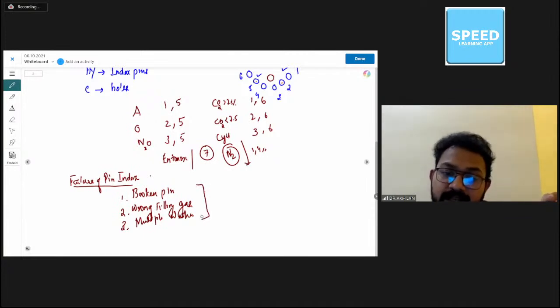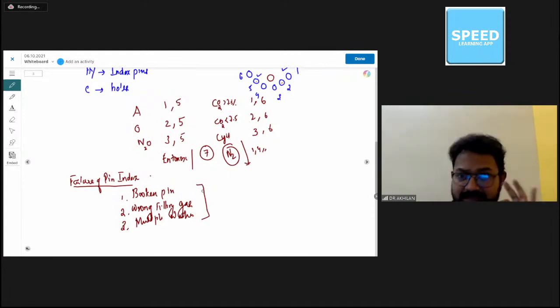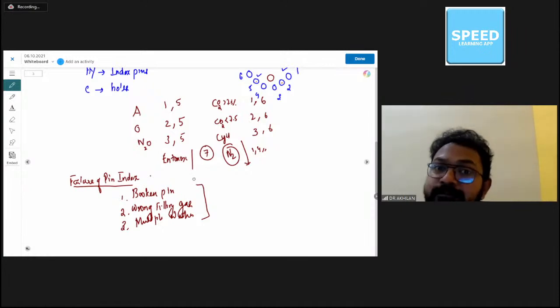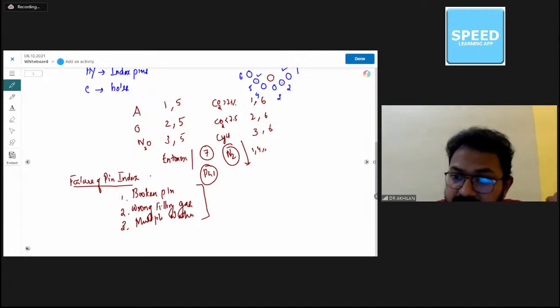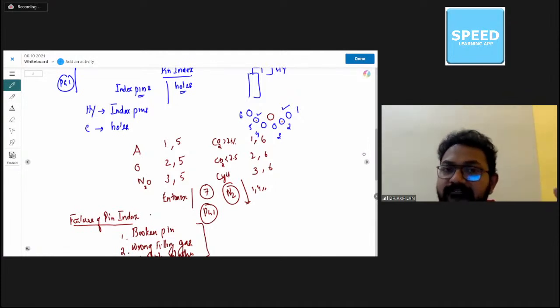Now, I've mentioned the causes which could lead to the failure of the pin index system. How many points did I mention? I mentioned 3 points. Whenever anything has 3 points, always remember you can expect an all-except question, right? And this was again a PGI question, so it can be considered a previous year INICET question, yes or no? Yes. So this is all you need to understand about the pin index system: how it works, what the pin indexes of different gases are, and what factors could lead to its failure. Only 3 concepts in the pin index system.